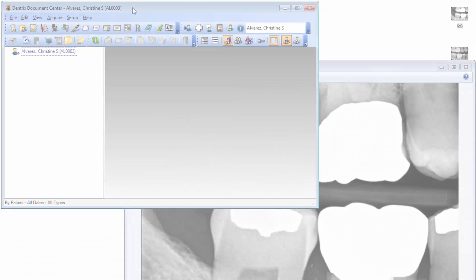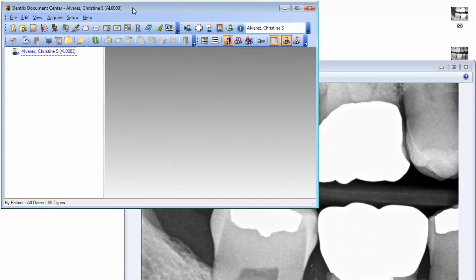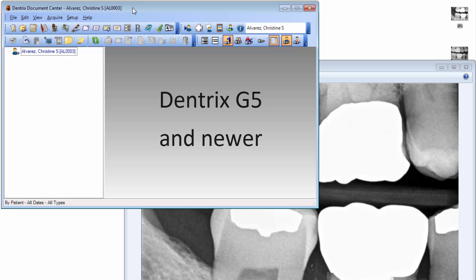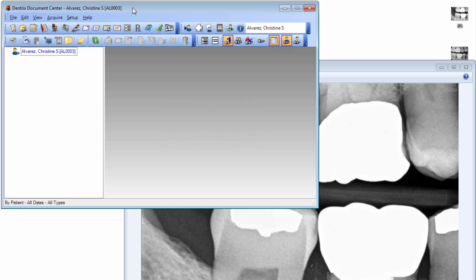Hello and welcome to Dentrix Does It. In this video, I'll show how to use the Screen Capture feature. This information applies to Dentrix G5 and later. Screen Capture allows you to select an area of your computer screen and save it as a graphic in the patient's document center.